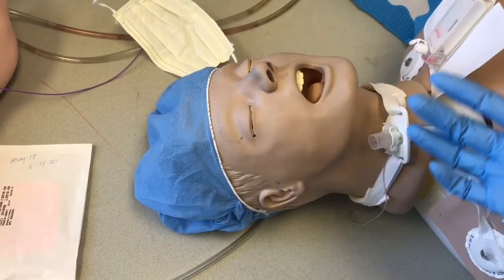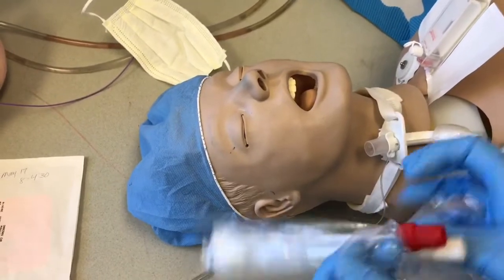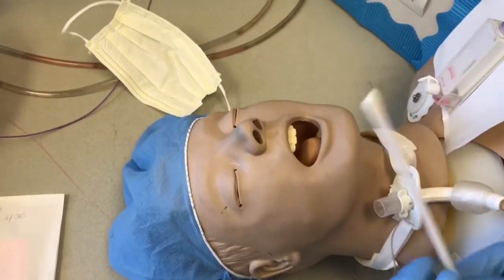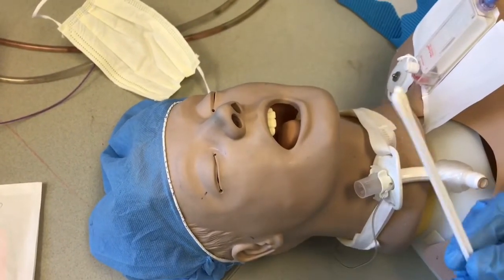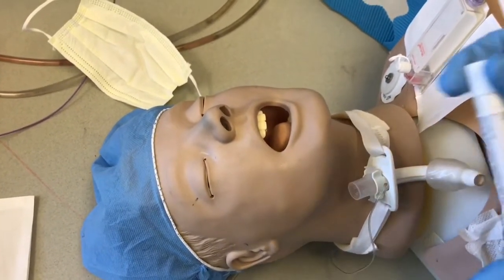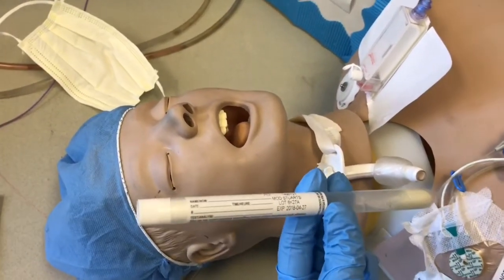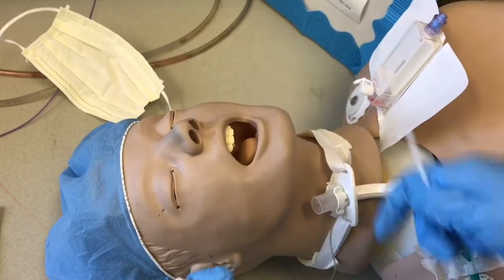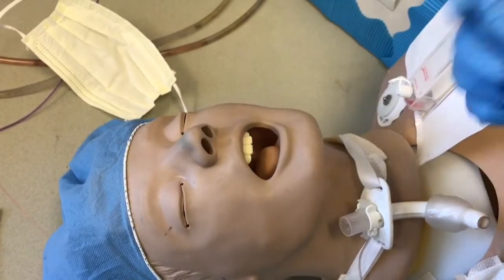Open your package up and there you go — your MRSA swab. This one is a two-swab kit; it depends on your facility on how they do it, but most places will typically use just one. Get your container, get your swab, make sure it's all labeled and ready, and make sure you have your biohazard bag available.